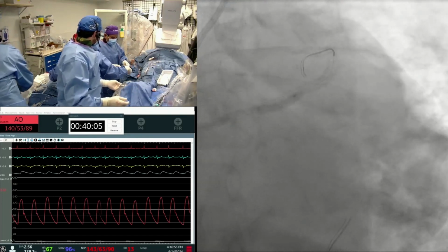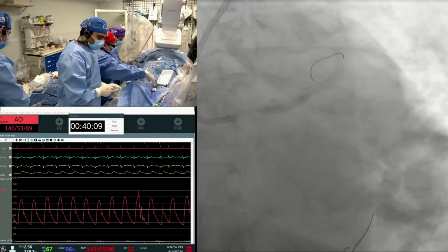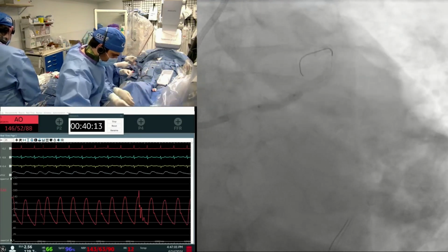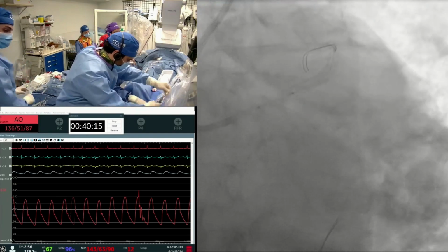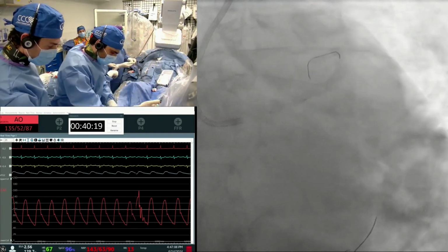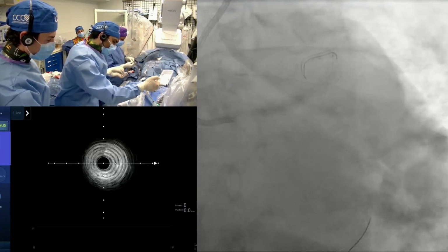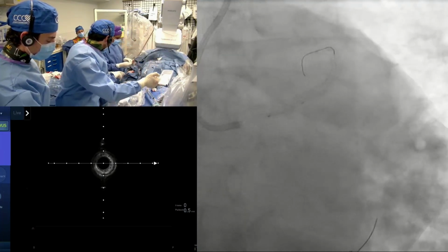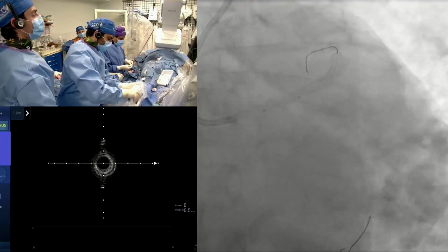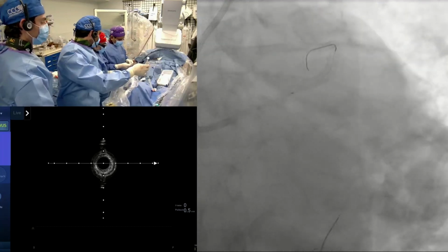Well, I still would think that it's going to be more than 2.0, just looking at this inflation. I'm surprised it's only 2.0. But that's why you need the IVUS, and it's super thick. But also, George, I think what's important is it's not just what the MLD is. It's also whether you got a fracture or not. Because if you have a fracture and it's small, it's still going to expand. Right, stent. That's why stents work. Exactly. Just to clarify, the IVUS was after the high pressure balloon. And Kiski said that there was only one cut.